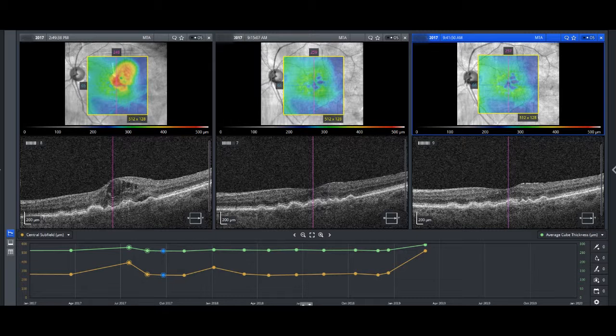In today's case, I'm going to show you a patient that I've been treating with an anti-VEGF injection for quite some time now. This is a 79-year-old female. And what you can note here in this image from back in July of 2017, is that there was some retinal thickening, intraretinal fluid, subretinal fluid, and after a series of anti-VEGF injections at once a month, July, August, September, you can see that the fluid comes down. Just as an FYI, all these little bottom undulations are drusen.